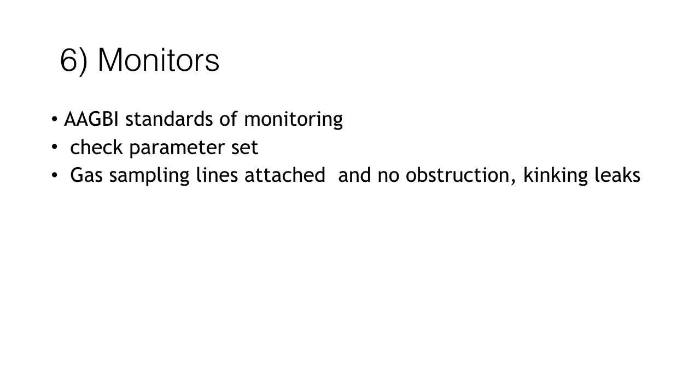Alarms should be set before using the anaesthetic machine, and also you can change the cycling times, frequency of recording of non-invasive blood pressure, and also set limits to what the adequate saturations are, heart rate, and blood pressure.